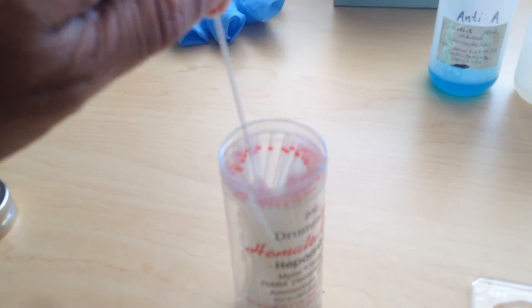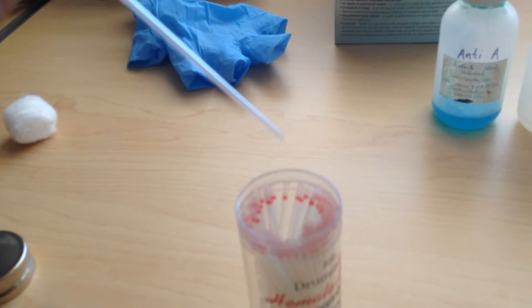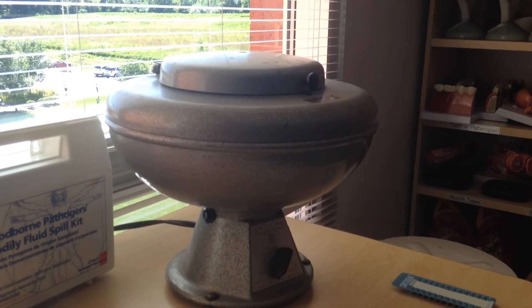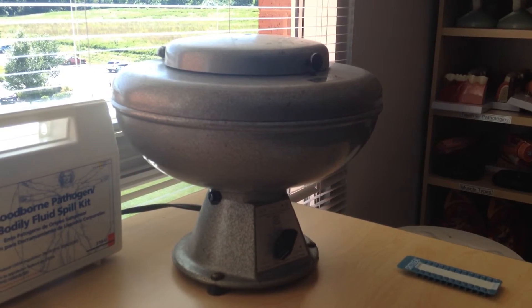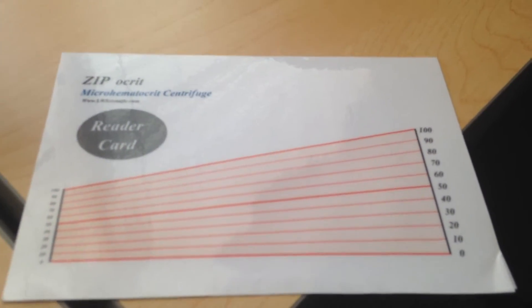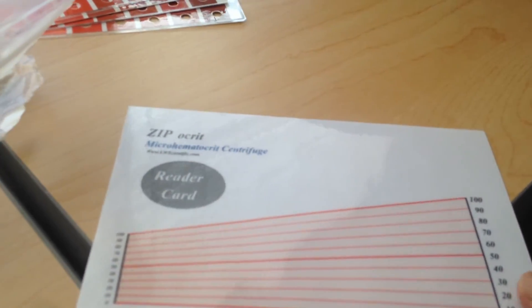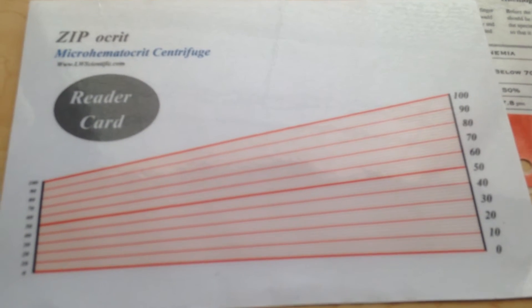Then we will do the hematocrit. For hematocrit you will need the glass capillary tubes. You have to fill the glass capillary tube three-quarters — that is 75 percent — with your blood. Then you will need the centrifuge machine. This will spin the blood, and you have to centrifuge it for three to four minutes. After centrifugation, the blood components — the plasma and the formed elements — will get separated.